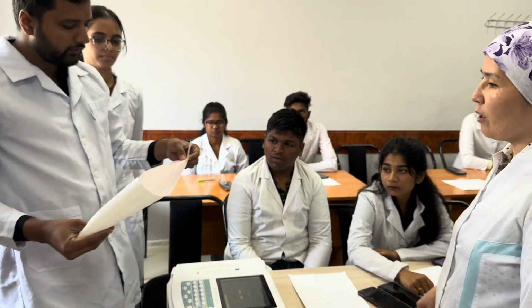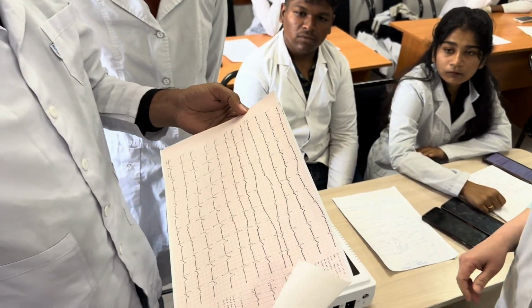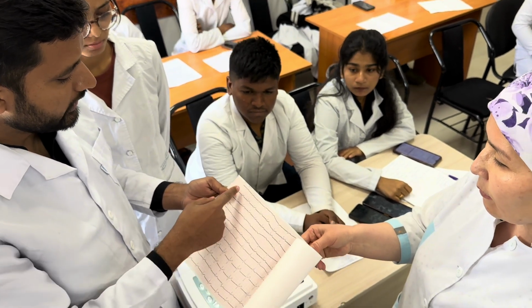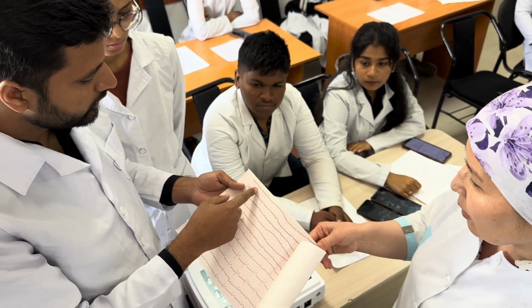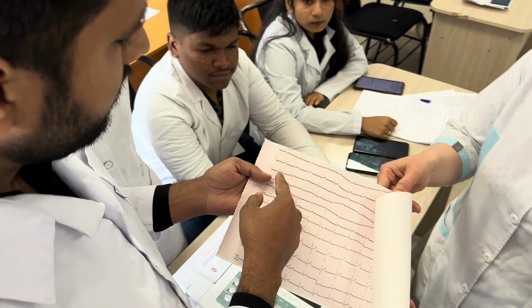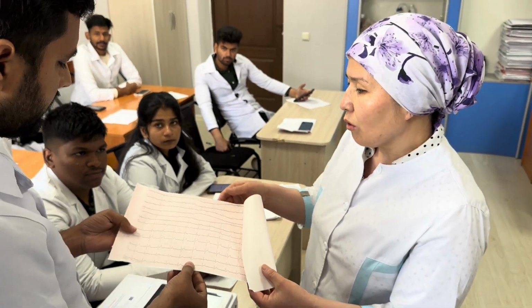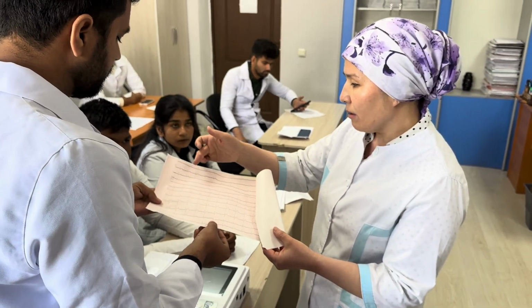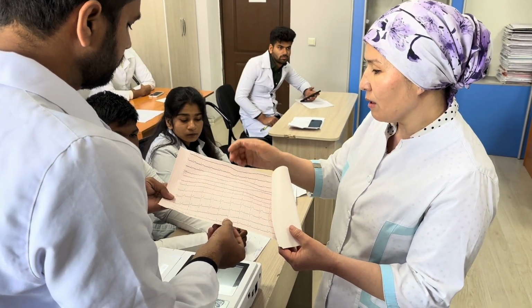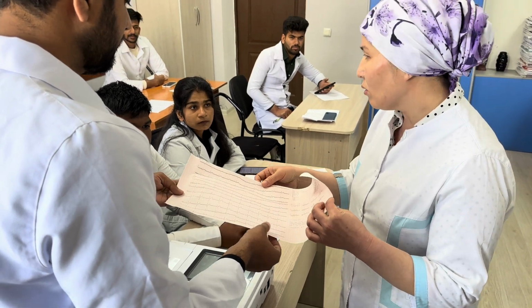And check. We found that it is a normal ECG. No ST elevation, no depressions. The P wave is normal. The QRS complex is normal, and the QRS width is the same. So every wave is in its place: P, QRS complex, intervals, segments, T. Everything is here. So it is a normal ECG.